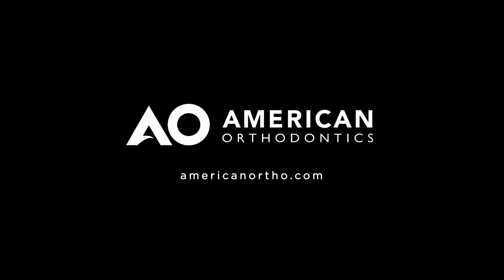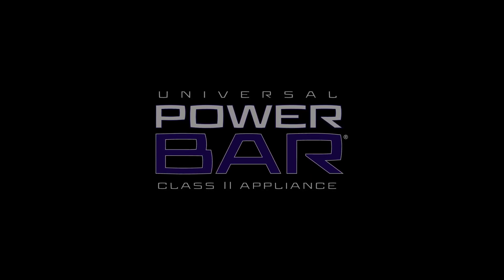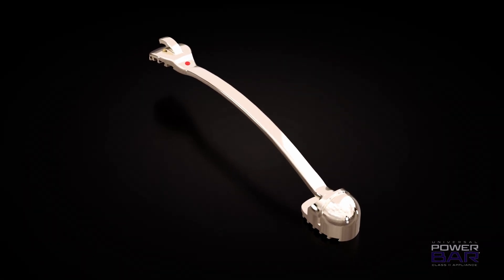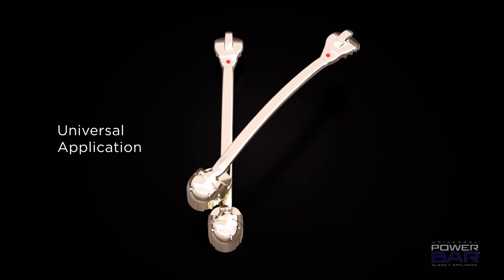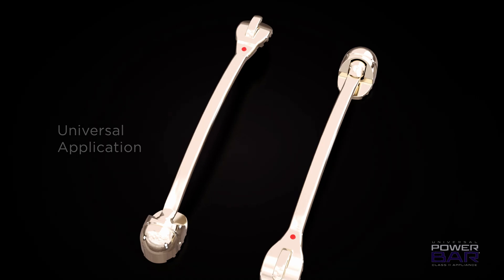Welcome to American Orthodontics' new Class II Corrector, the Universal Power Bar Appliance. We are excited to offer the Power Bar as an early treatment option for treating Class II malocclusions. The Power Bar is a direct bond orthodontic appliance that you can use in either quadrant because of its universal design. It will correct a Class II into a Class I by efficient segmental tooth movement.